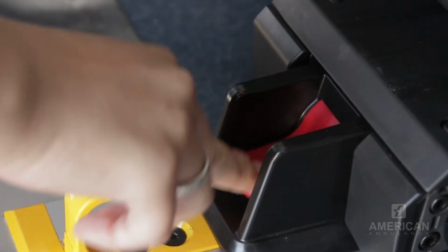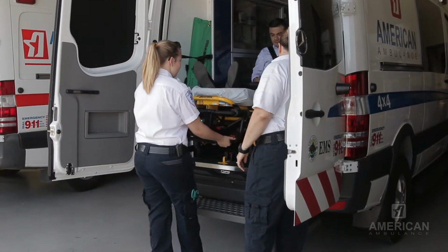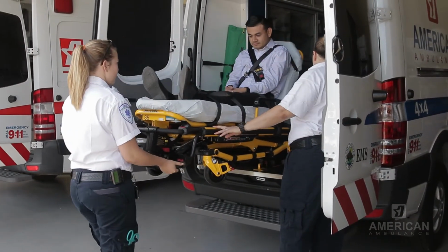The first thing we're going to do is press the red release button. That releases the locking mechanism and allows the gurney to glide out on the power load system. As the gurney is gliding out, you want to just position yourself: one crew member at the foot end of the gurney and one crew member on the side of the patient. So as the system is rolling out, we're just providing comfort to the patient so they know we're here.